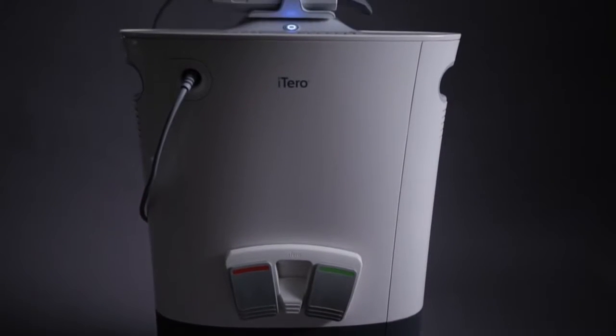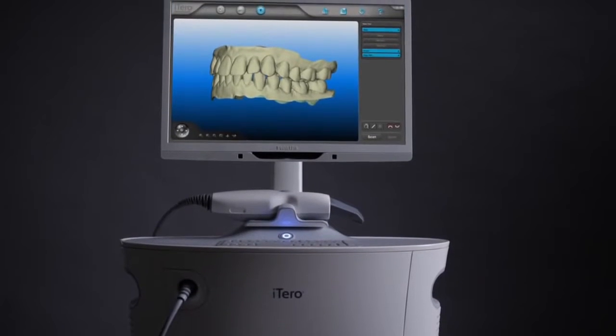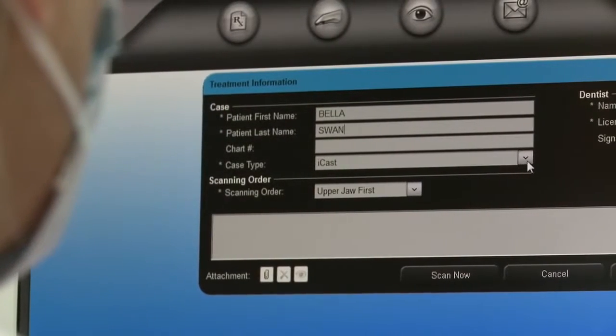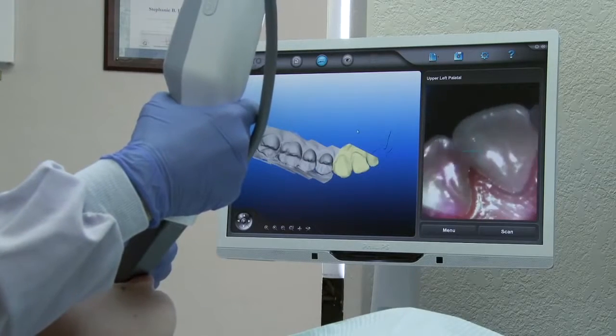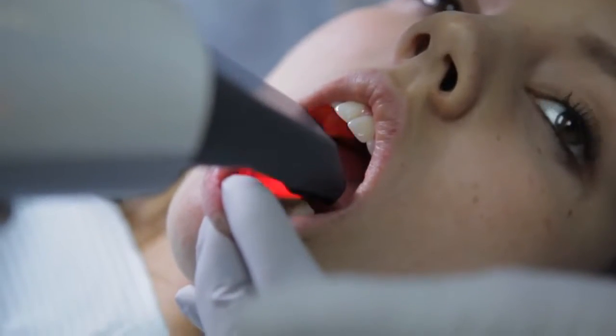The main benefit of the scanner is the efficiency of time and the accuracy of the scan. After entering the patient's prescription into the iTero system, scanning for orthodontic treatment begins. The guided scanning process proceeds through each quadrant of the jaw, and the ergonomically designed wand makes scanning comfortable for both operator and patient.